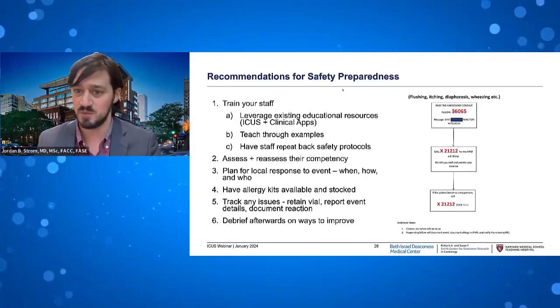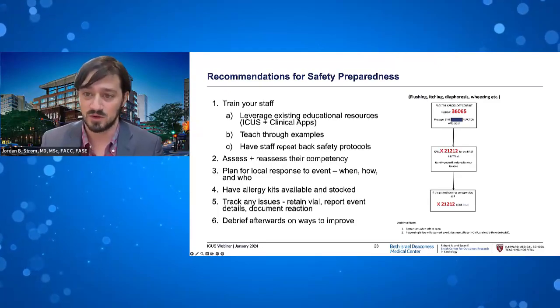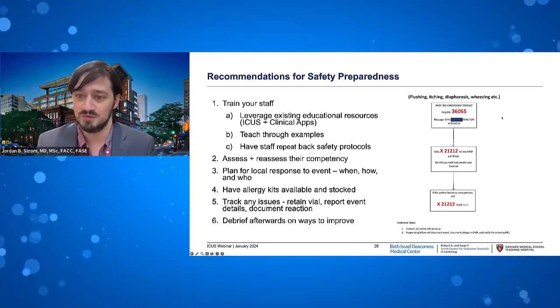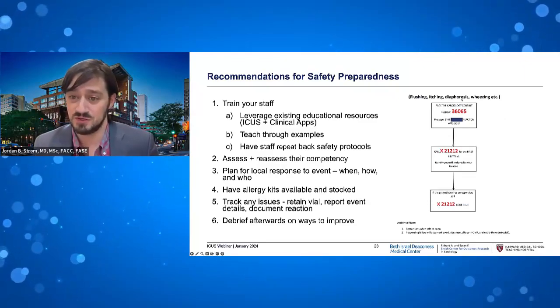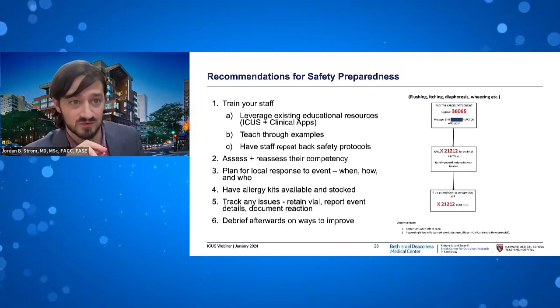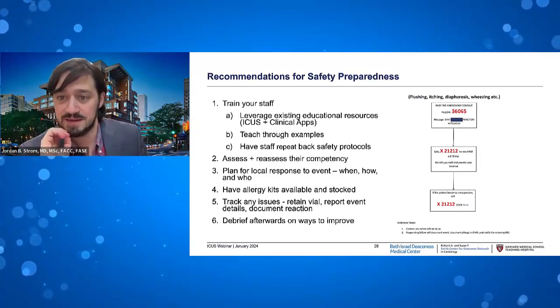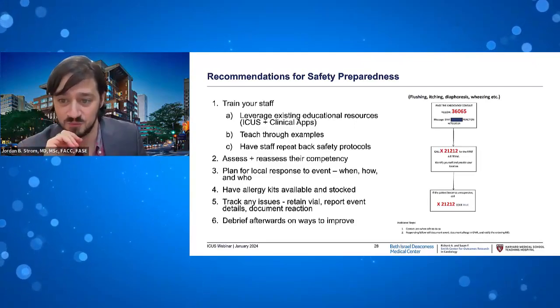So this is our form that we have on the right here. This is what we have in every single site where contrast is used. We have set it up at Beth Israel so that the cardiology consult fellow is paged, and this goes out as a bubble page. They carry a bubble pager, and so there always has to be somebody. We know that there's somebody on call for the bubble pager, and as soon as this goes off, it comes up as a stat reaction with the location.